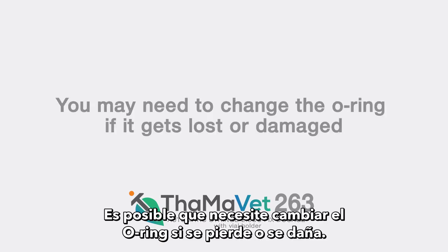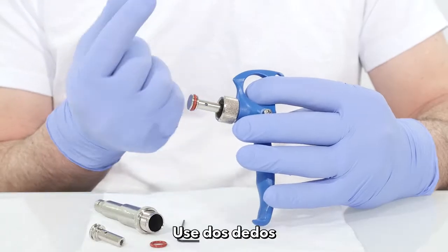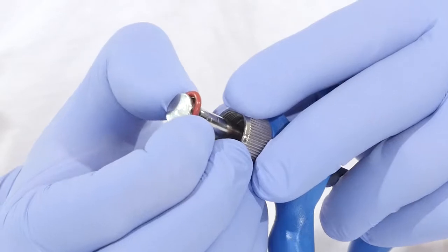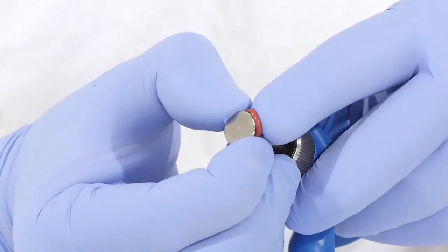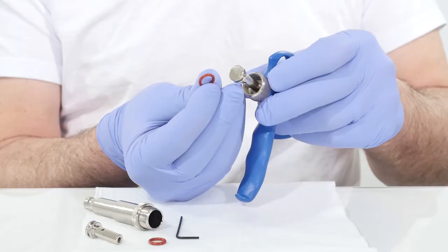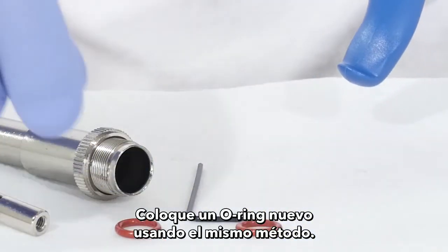Replacing the o-ring: you may need to change the o-ring if it gets lost or damaged. Use two fingers to press and release the o-ring, then using a third finger, slide it out gently. Put a new o-ring in place using the same method.